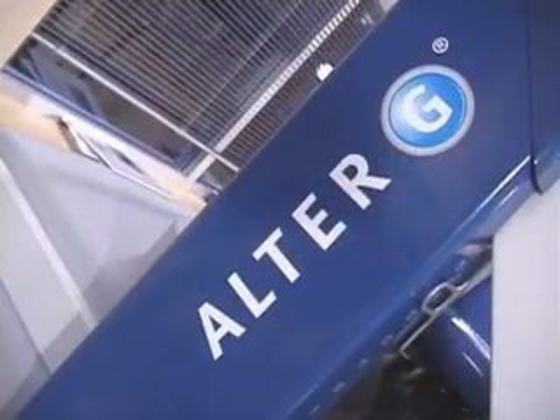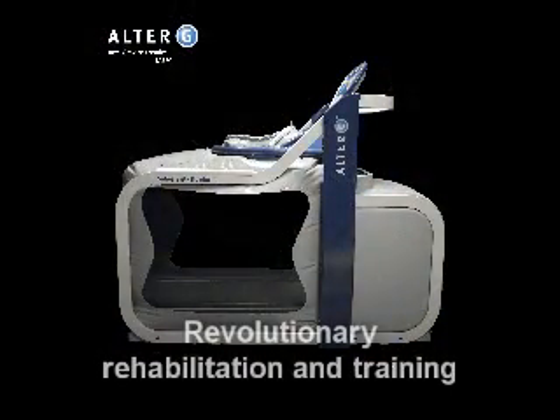She's using the Alter-G system to treat a number of injuries, from overuse to torn ligaments, even rehab for hip breaks and fractures. Alter-G: the revolutionary anti-gravity treadmill for rehabilitation and training.